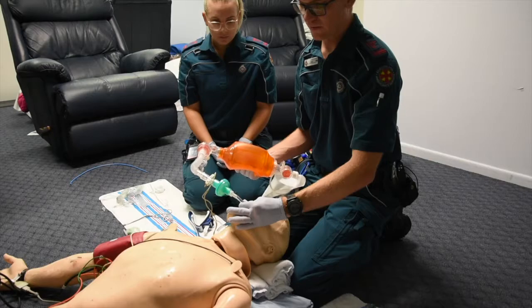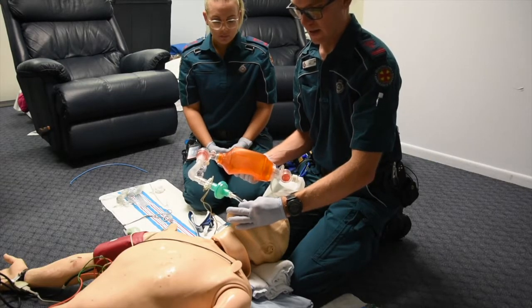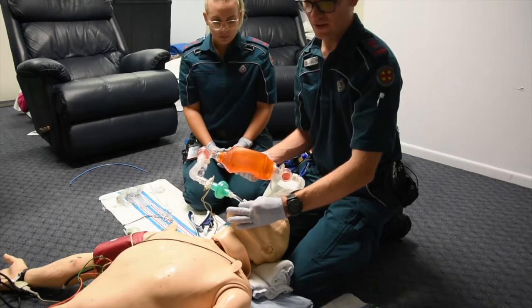Other ways you can tell if you've got intubation in place is obviously x-ray, but we don't really have that in ambulances. And obviously an improvement of the patient's condition, so we want to see if our saturations come up.